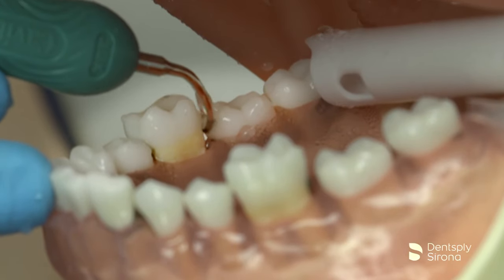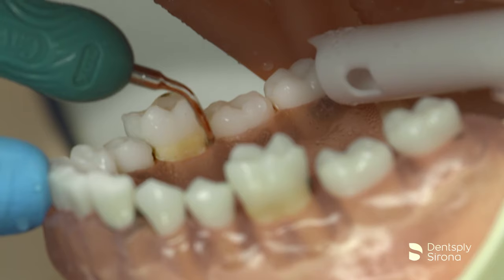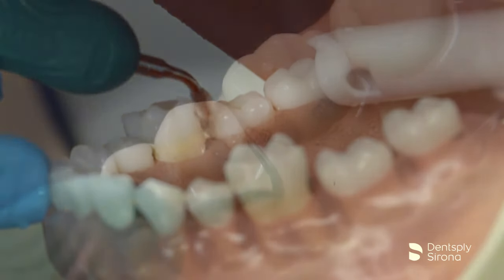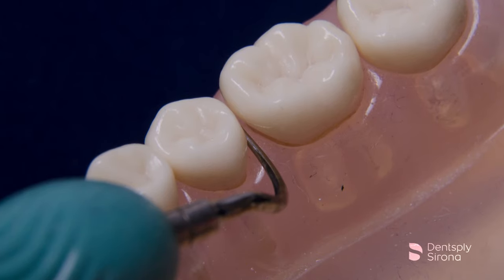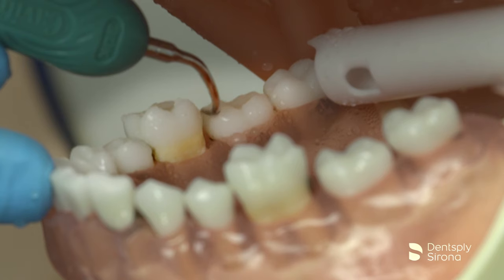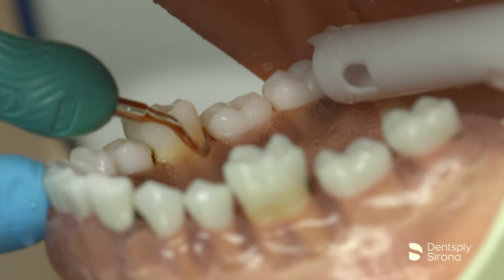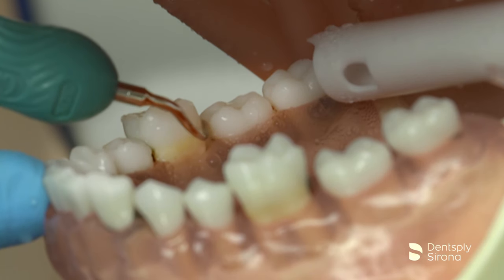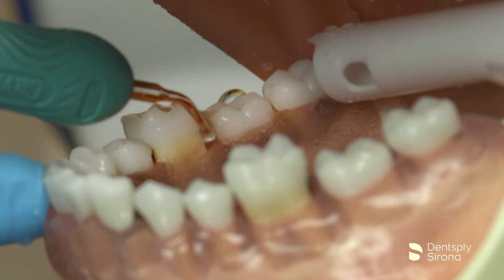The curved inserts are ideal to reach under the contact areas supragingivally in what is known as the transverse approach, similar to using a NEVI or a 204S posterior sickle scaler. The curved inserts can be adapted to the mesial and distal surfaces utilizing the lateral surface of the tip. The clinician is using proper adaptation for transverse approach supragingivally under the contact.